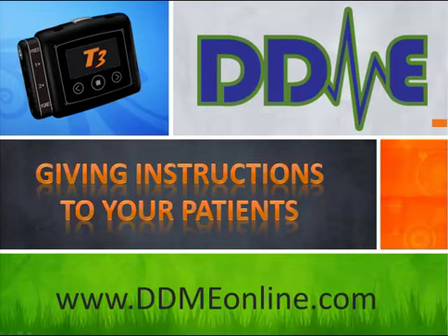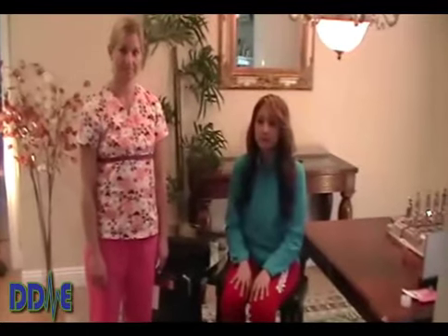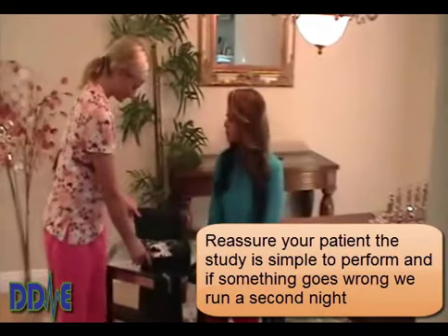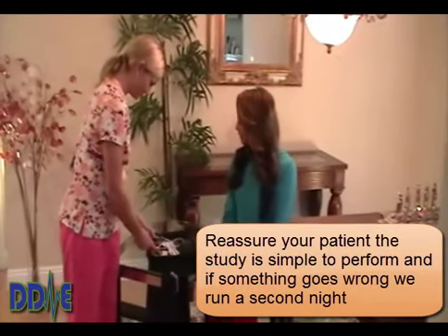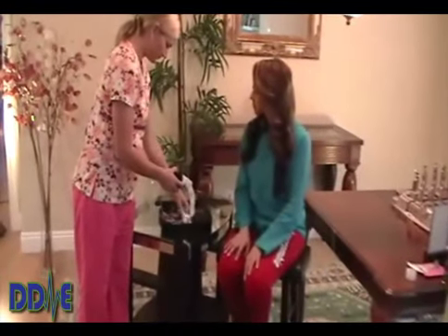Give instructions to your patient. There are two objectives: one is to give instruction on how to attach the sensors, and the second is to reassure your patient that the study is simple to perform. And if by chance something goes wrong, let them know it's fairly easy to repeat the test.